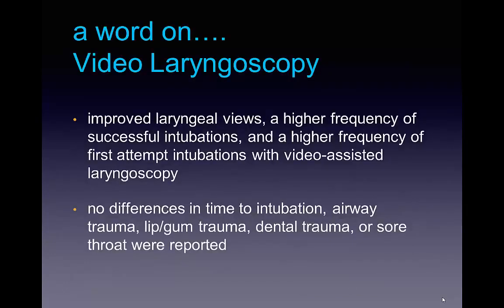Just a word on video laryngoscopy. There is some notion out there that video laryngoscopy sometimes can cause difficulty in first pass or cause the length of time for delivery of the endotracheal tube to be increased, and this is in fact not the case. Video laryngoscopy has been shown to improve first successful intubations and first attempt intubations, and doesn't usually add additional time in the hands of an experienced provider.